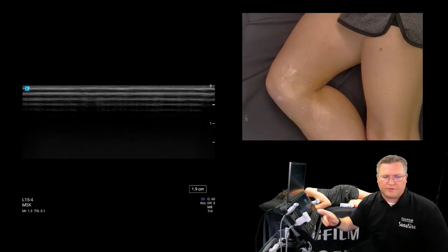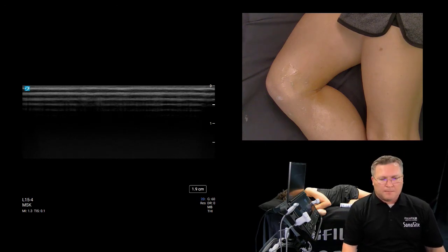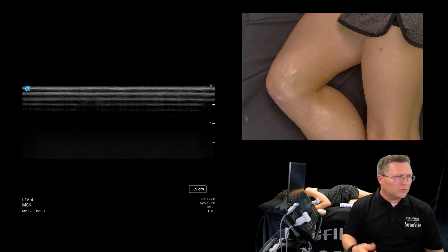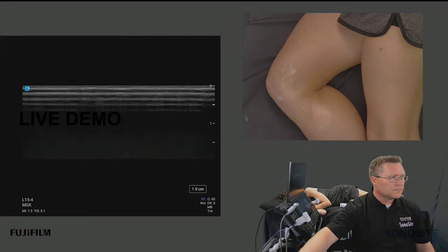So that is the end of the live scan portion, Chris, and we'll use this brief moment to call that the clean recording, and then from here on we'll moderate any questions in the live chat. If you guys have any, go ahead and send them my way. Yeah, like Daniel said, go ahead and put your questions in the QA box if you have any. We'll wait for a little bit. Doesn't look like there's anything in there currently. So we'll wait just a little bit and see if anyone has any questions for you, Daniel.